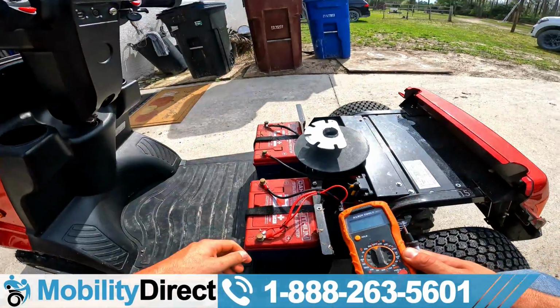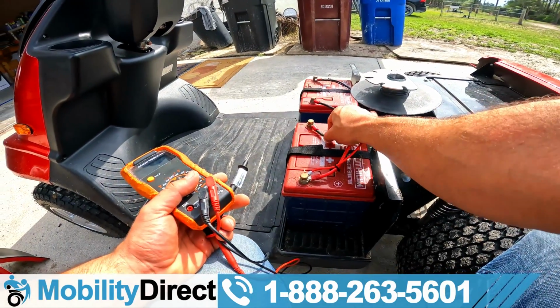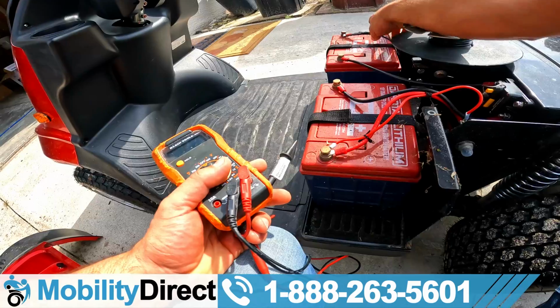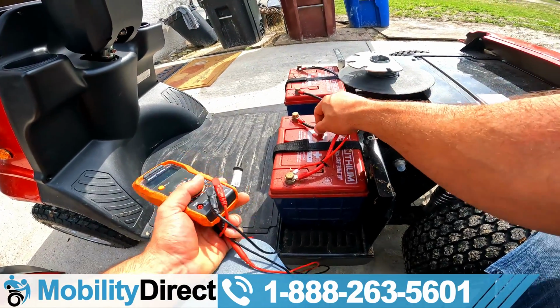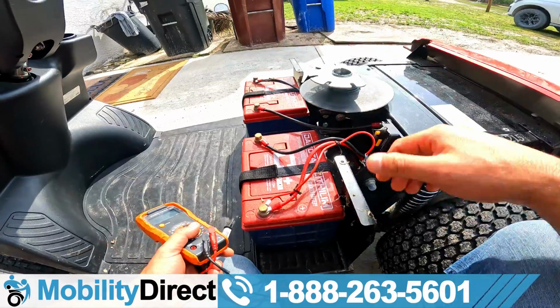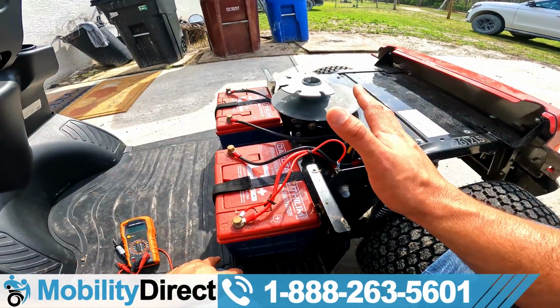So we really want to first inspect all the terminal connectors, make sure nothing's loose. Oh, look at that. That's loose. That's tight, and the rest of them are tight. I'm just doing a little hand wiggle test, and I noticed, look at that one. You can clearly see it's loose. These are tight, and this one's loose. So the error 1 code was perfectly accurate.